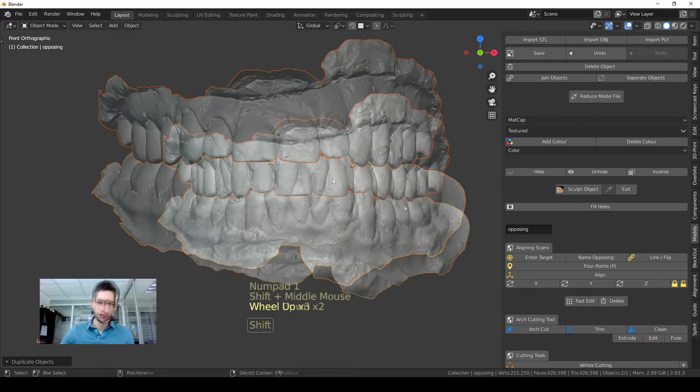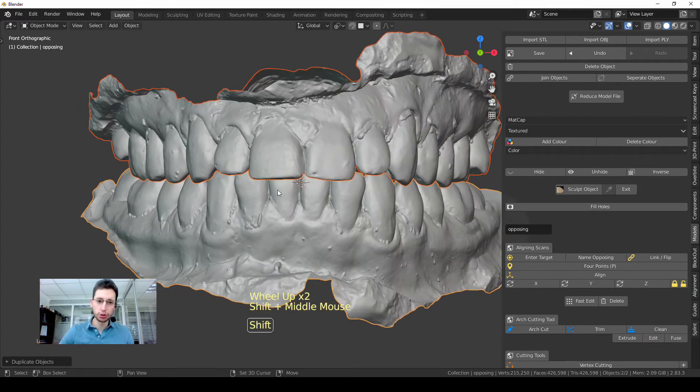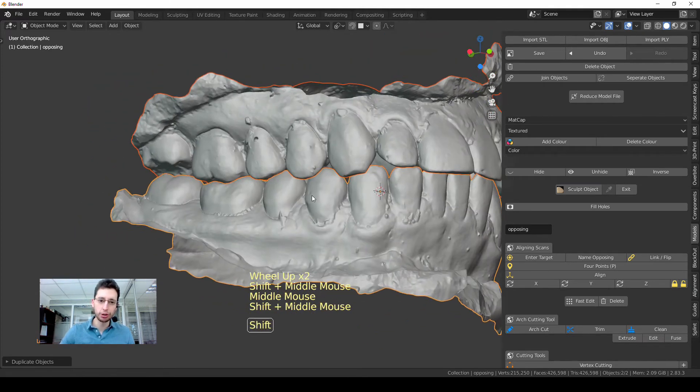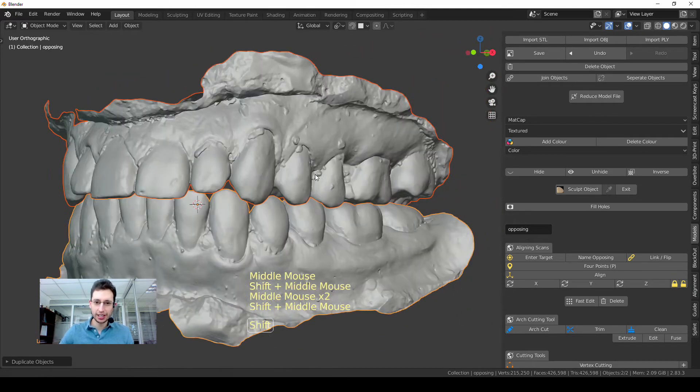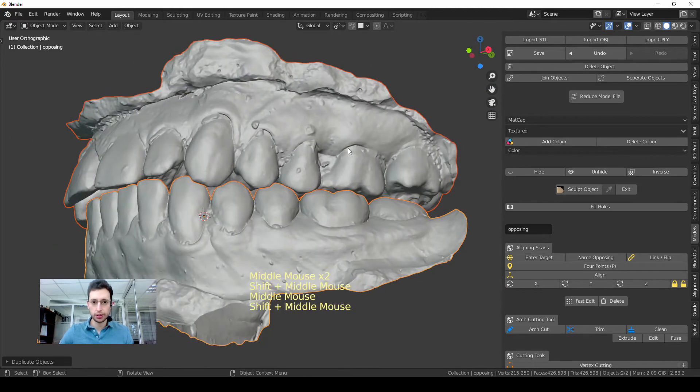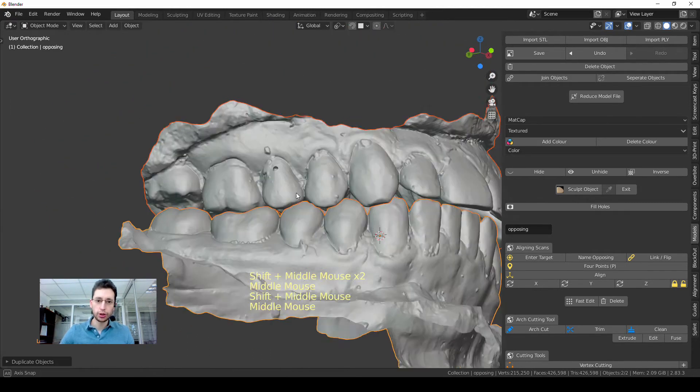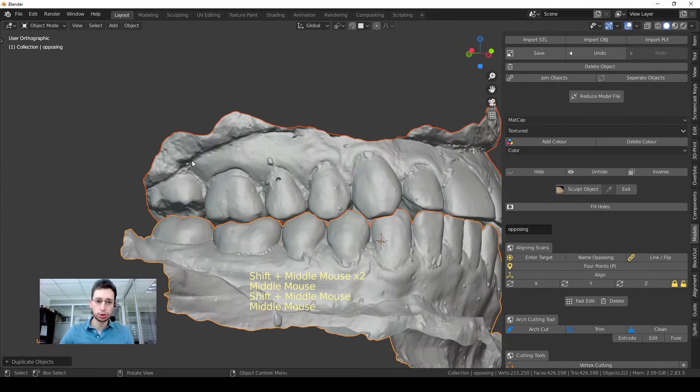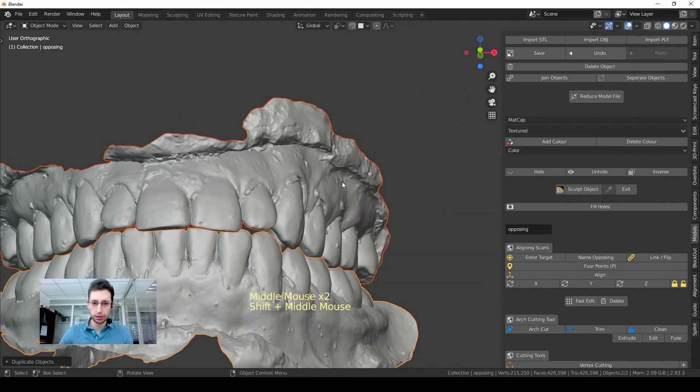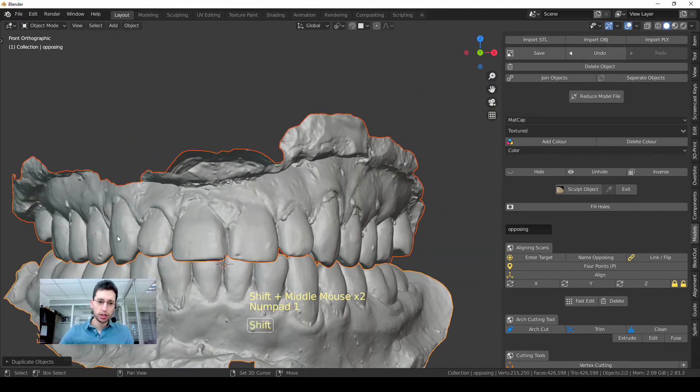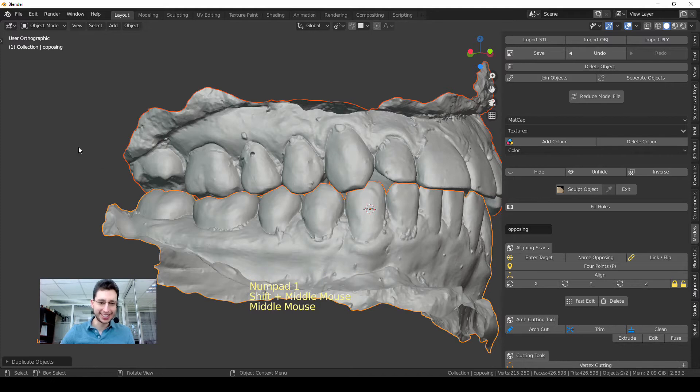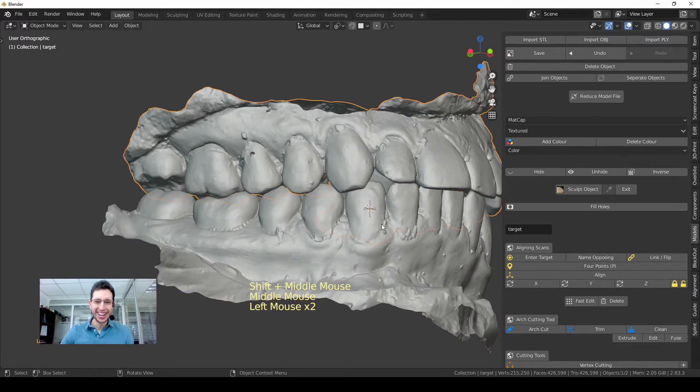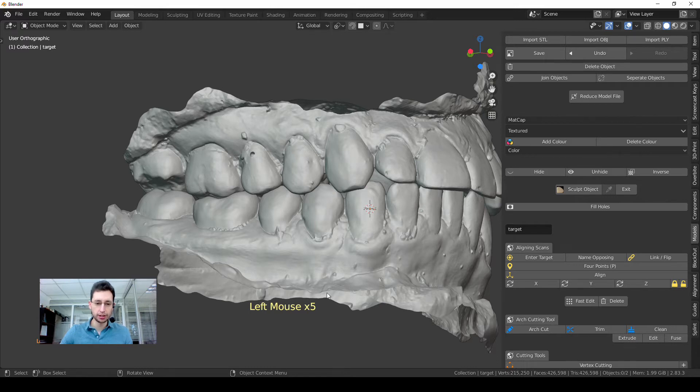The first thing to do is to clean them up a little bit. As you can see, these are plaster models, scan plaster models, so I have to remove all those imperfections and irregularities. Anyway, you have all the keys I'm pressing and the mouse buttons in the lower part of the screen so you can follow along.